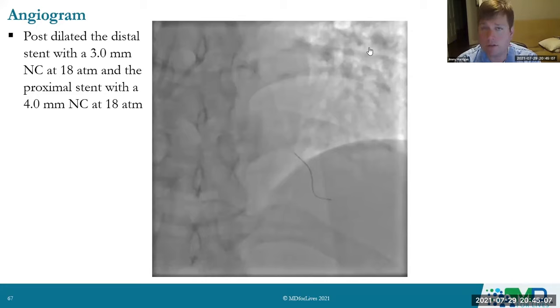The patients are on blood thinners, on heparin, to prevent that from happening. Overall, we don't put IVUS into vessels we don't intend to fix for that reason, and using IVUS helps us treat these patients better. So when possible, putting it in before and after is safe and effective in order to reduce the chances of stent thrombosis and in-stent restenosis, and maybe other things depending.